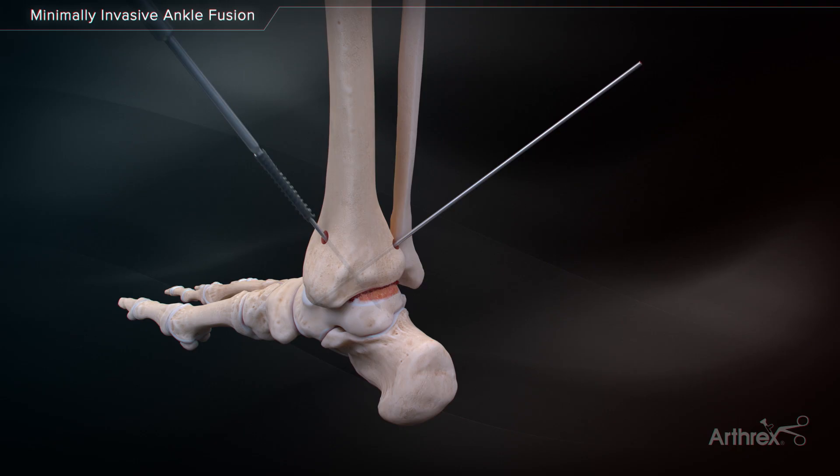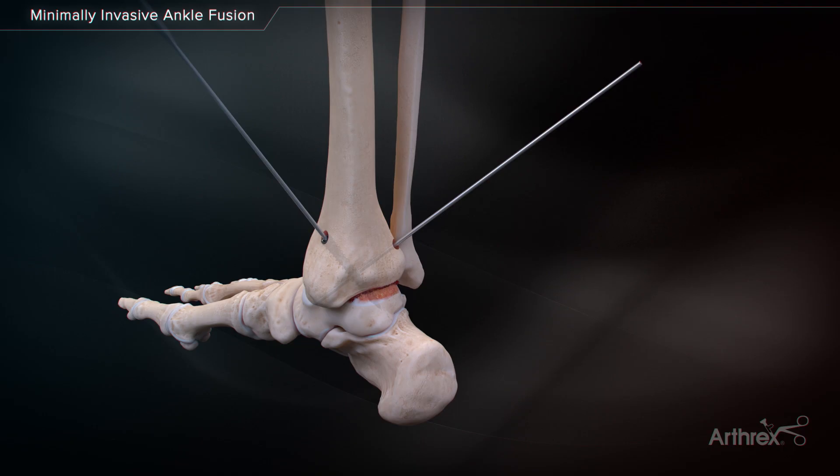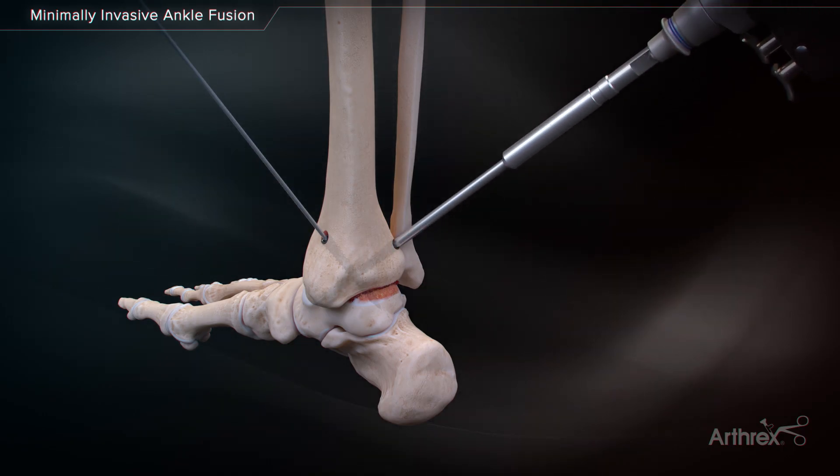Two 7.0-millimeter compression FT screws can be placed over these guide wires to establish initial fixation and compression across the arthrodesis site.